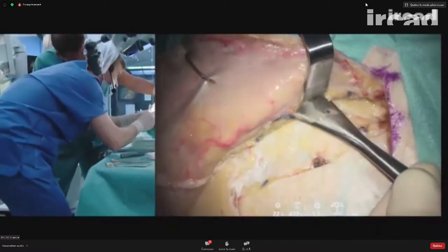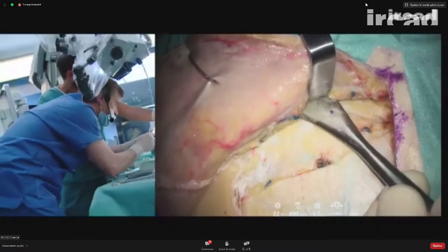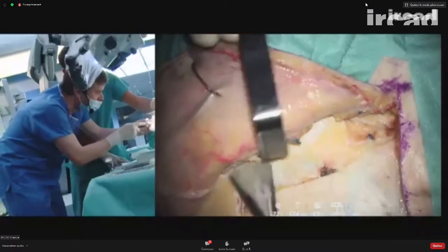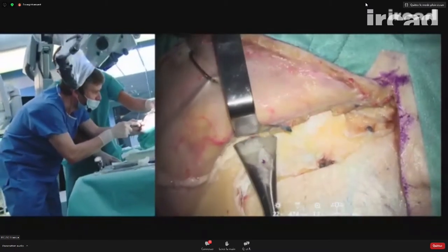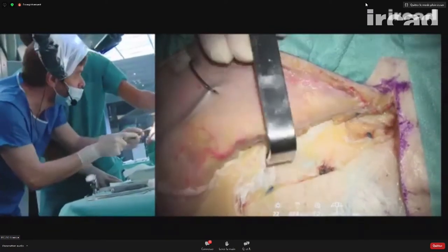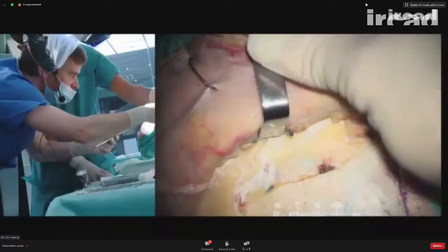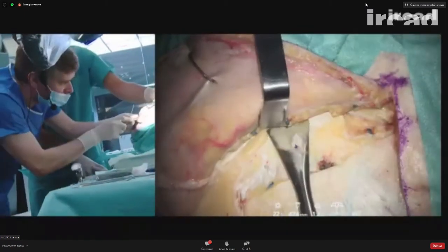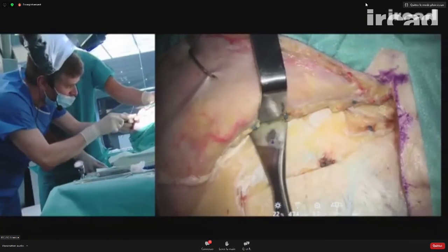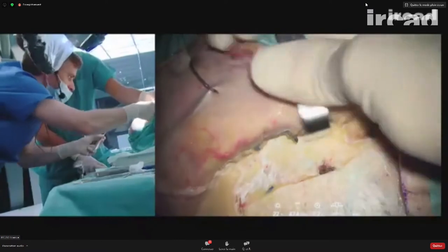Here is a zygomatic arch, and I progressively expose here the body of the zygoma. And you see that the deep fascia really leads me on the body of the zygoma, lateral rim of the orbit and zygomatic arch.